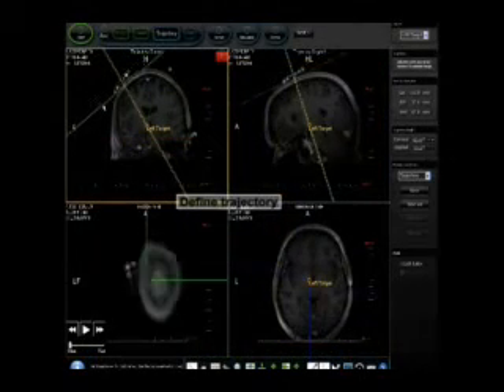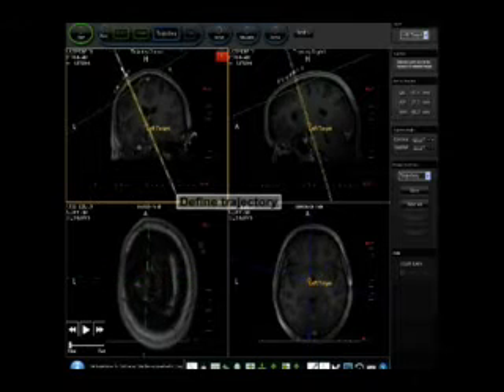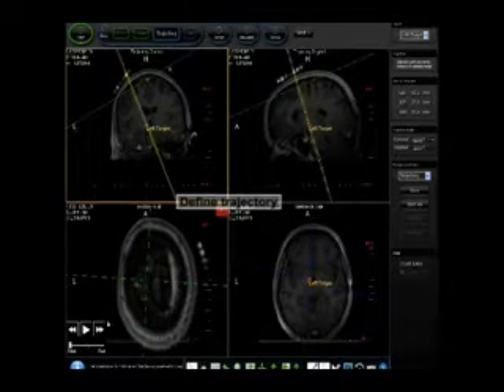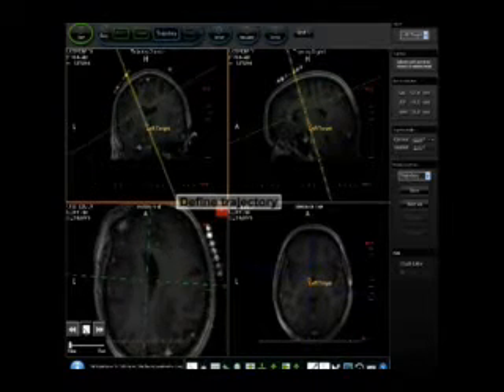Once the target is selected, the surgeon uses the ClearPoint software to find an optimal trajectory path from the surface of the skull down to the target. The software simplifies this process by visualizing critical structures that need to be avoided, such as blood vessels, sulci, and the ventricles.